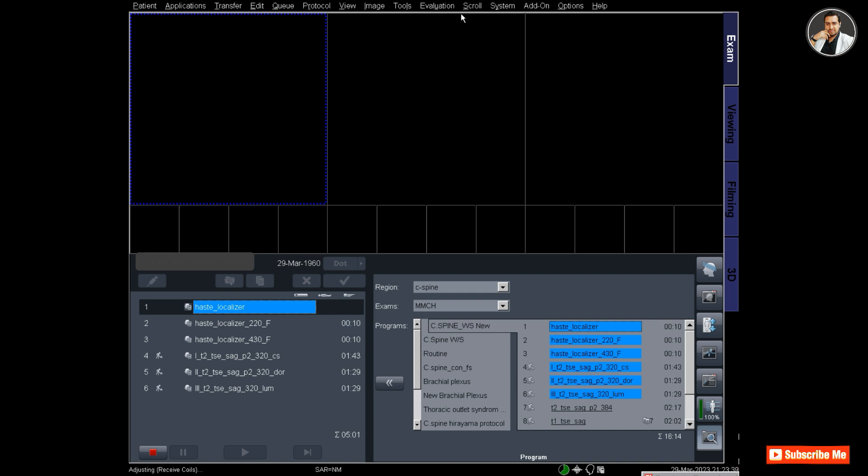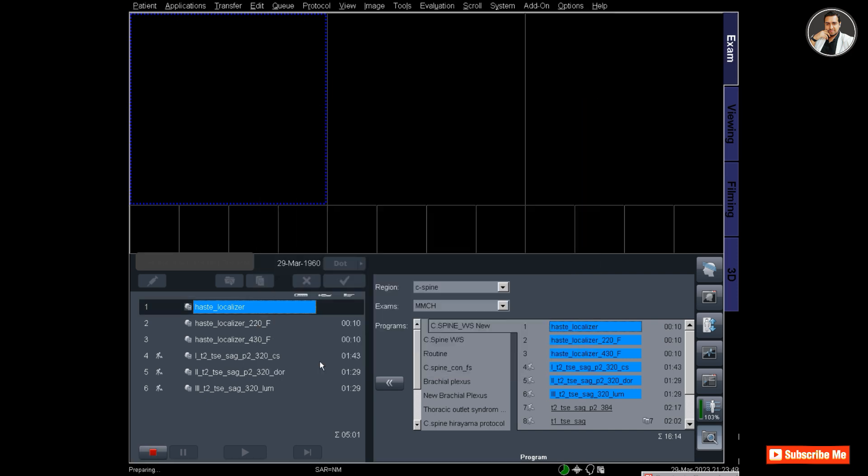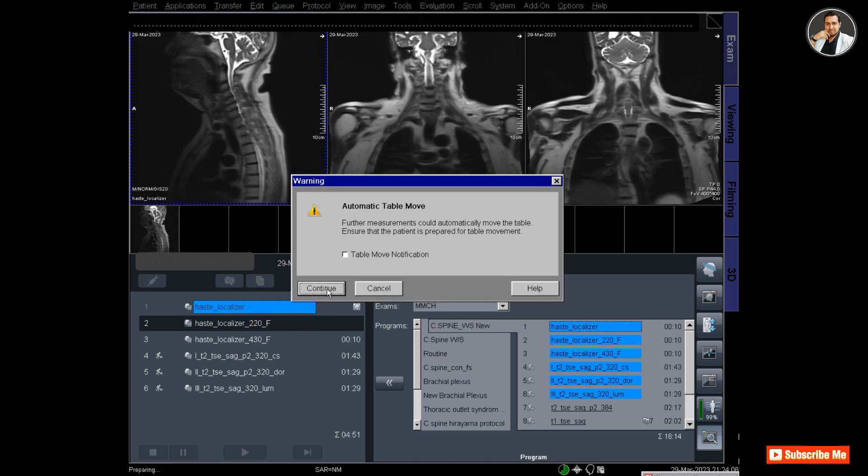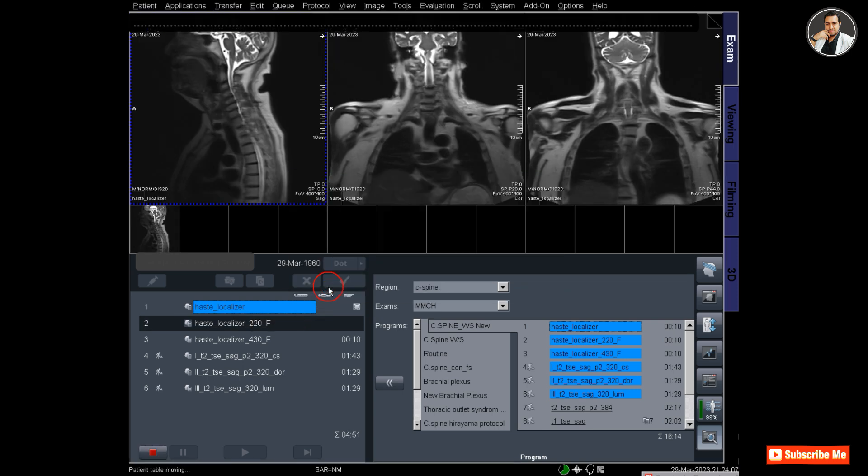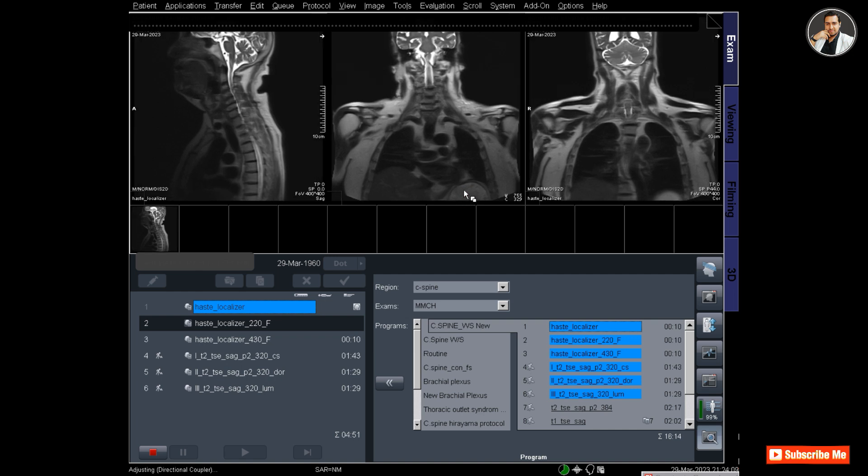The top three are localizers for cervical, dorsal, and lumbar spine. The bottom three are T2 sagittal sequences for cervical, dorsal, and lumbar spine. The technique is that these three sequences are composed together to make a whole spine. Let's see how it works. The cervical spine localizer has been completed and images appeared in the exam segments.